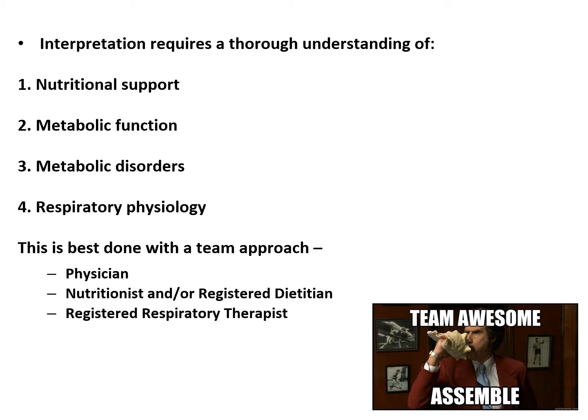And they had a sample line that would get those gases and then put it back to the mass spectrometer that actually gave us all these values that we needed. And then we put them into a computer, or these small little calculators that we had, and they would give us the RQ, the oxygen consumption, the CO2 production, the oxygen delivery. It was pretty cool, and they would use those numbers in rounds to adjust their nutrition.